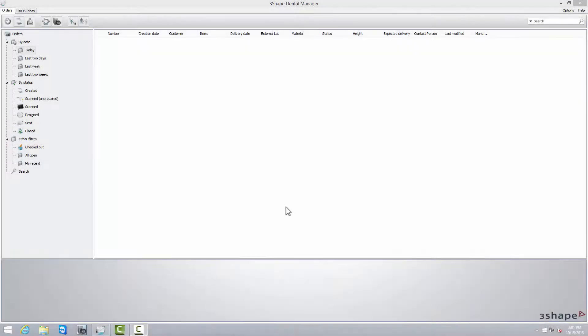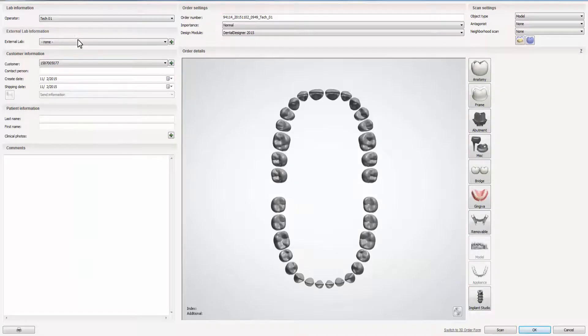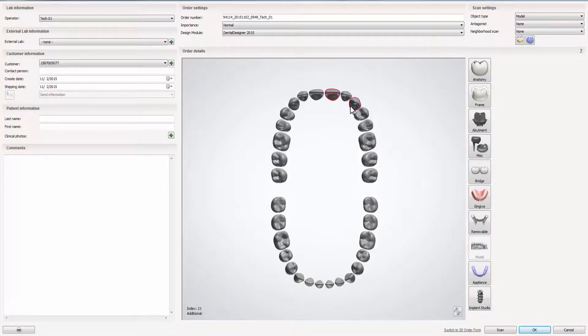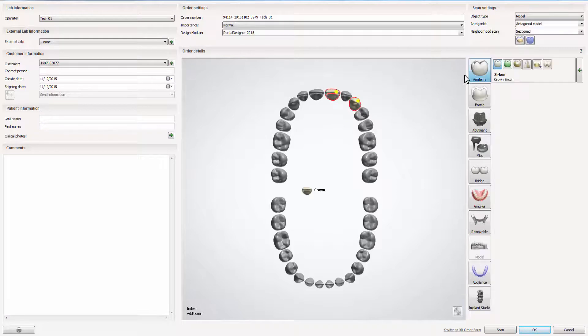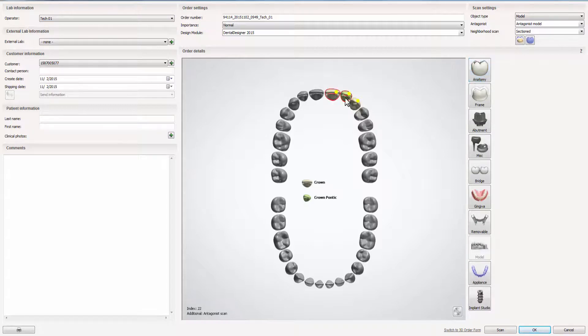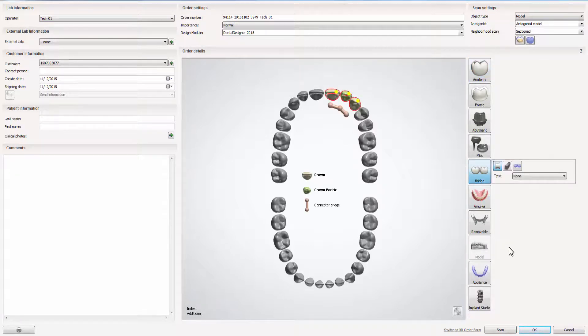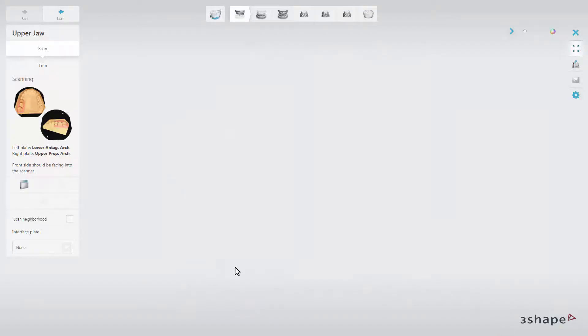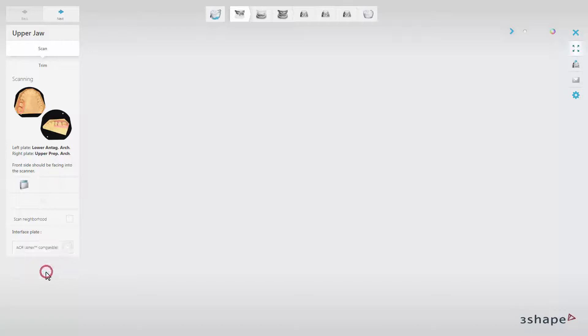Create a new case, then launch the ScanIt Dental scanning application. In the interface plates drop-down list, choose the correct articulated interface plates and start scanning. Scanning of bite will not be necessary.